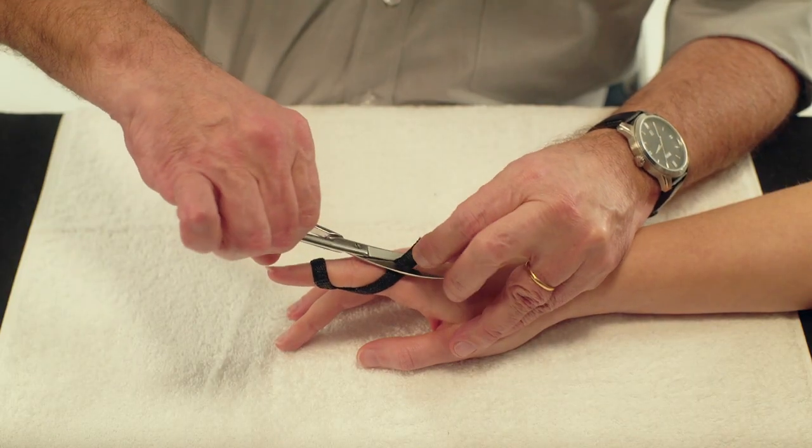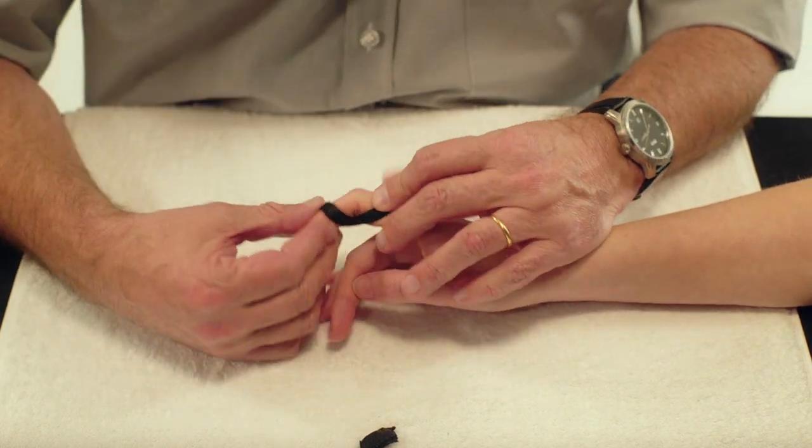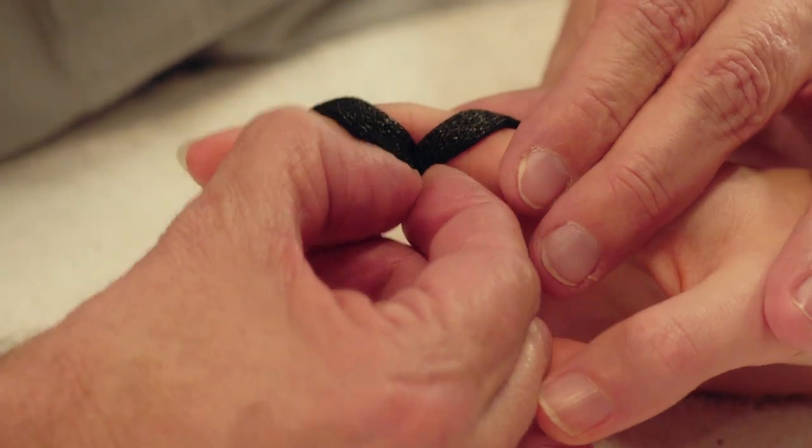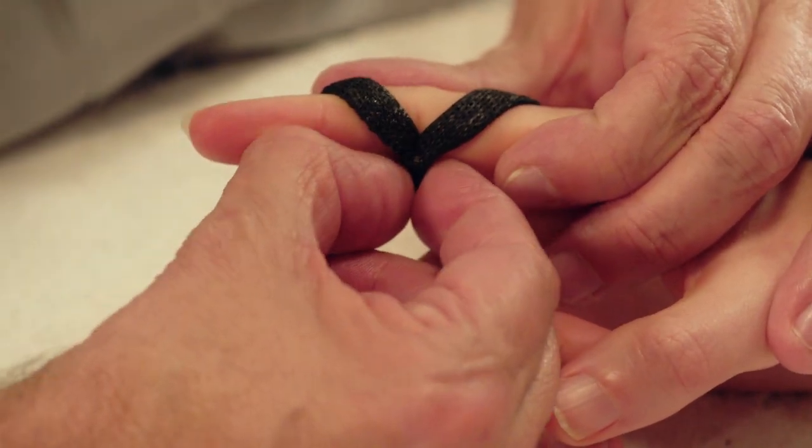Cut away any excess material. Put the PIP joint in a flexed position and press the material in the flexion crease firmly together to limit its bulk.